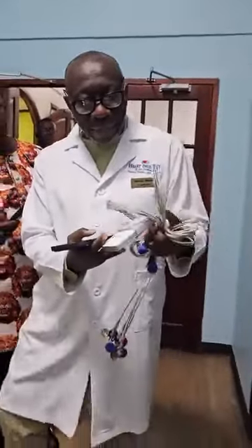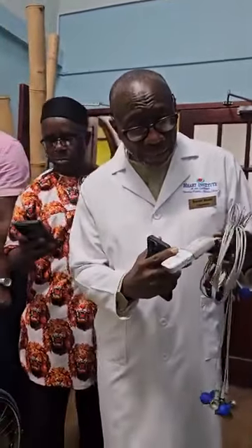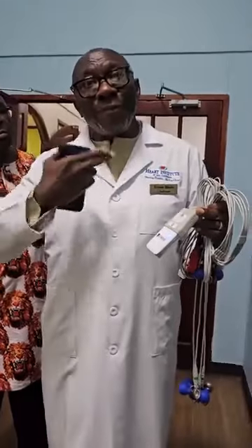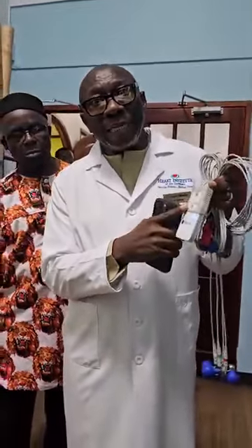Explain it. So this is a new technique, new technology for electrocardiography. This is from QT Medical. Rui Kang is the chairman of the company, a professor at UC San Francisco. We use this advanced technology as opposed to the big machine that you have to wheel around. These are the electrodes put on the chest, and the electrocardiographic signals are acquired and go either via Bluetooth or internet connection into a cloud server.